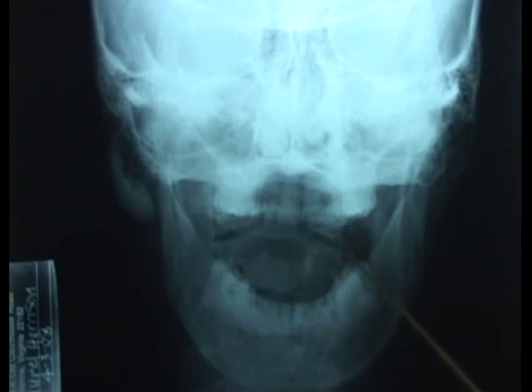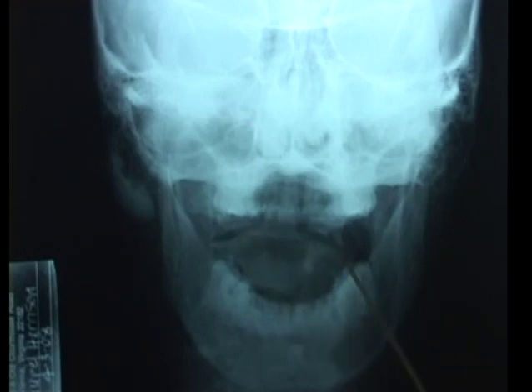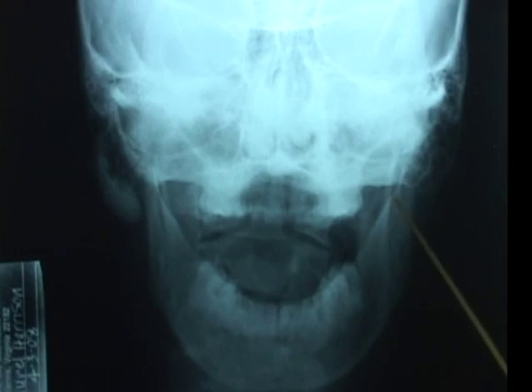You can see that the lateral process of C1 lines up with the lingual cusp of the teeth in the upper arch on the right side, and on the left side it lines up with the buccal surfaces of the teeth, meaning the skull is either displaced to the patient's right or the cervical spine column is displaced to the patient's left. You can see that the foramina through which the nerves go are not aligned properly. You can see that this mastoid process on the patient's right side is much higher than on the left side.